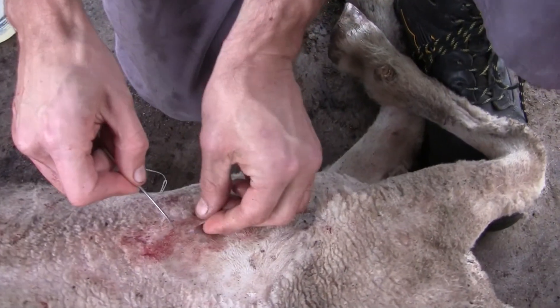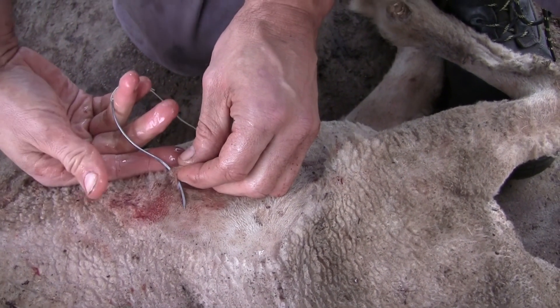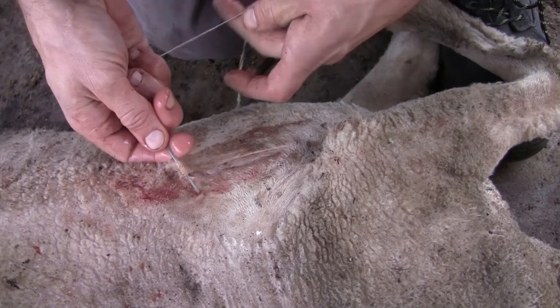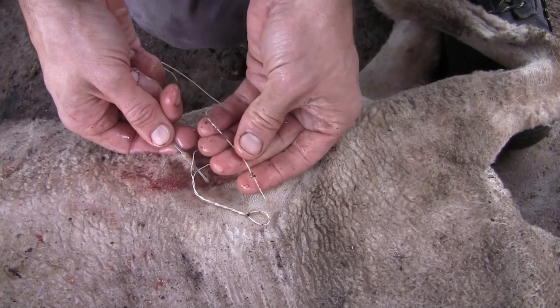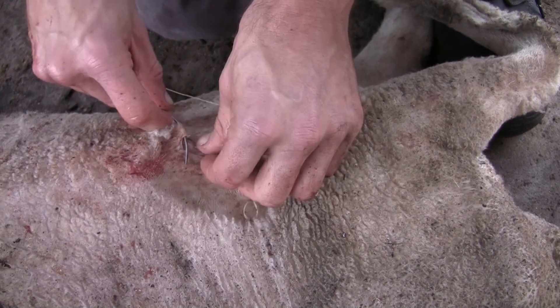Take the first layer of skin on the side and put through the needle, which is the shearer's needle or S-shaped needle, also known as a post-mortem needle, with the thread which is going to be an extra strong cotton. At the end of that thread we also have a knot already placed, enabling the suture material not to run through the skin.